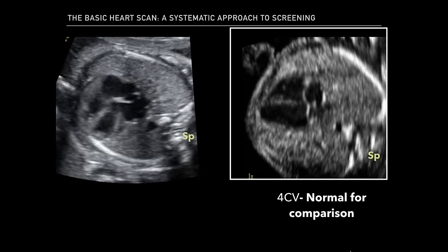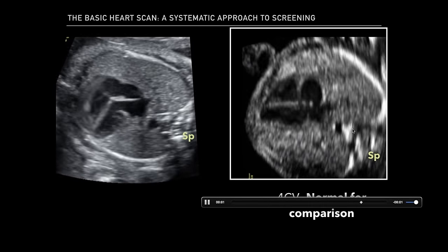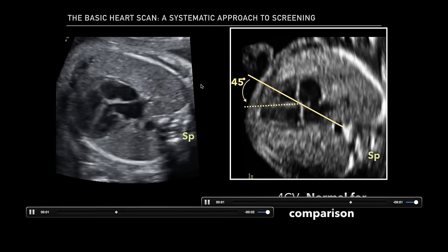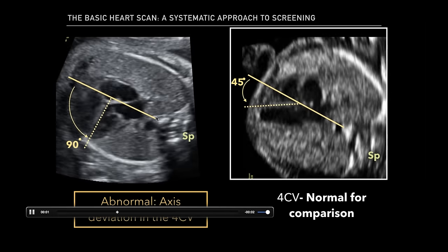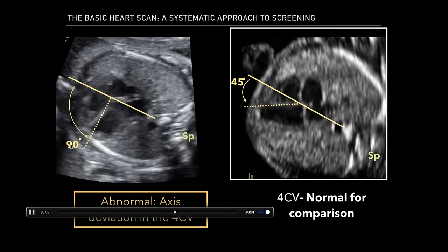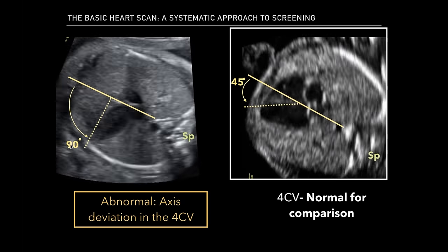So what do we actually see here? Here we see a normal four chamber, normal for comparison, and it has a normal axis of 45 degrees. As you look at this clip, we can see that it's obviously a completely abnormal axis, with the heart deviated over towards the left side. This is about a 90 degree axis deviation, so this is clearly abnormal.